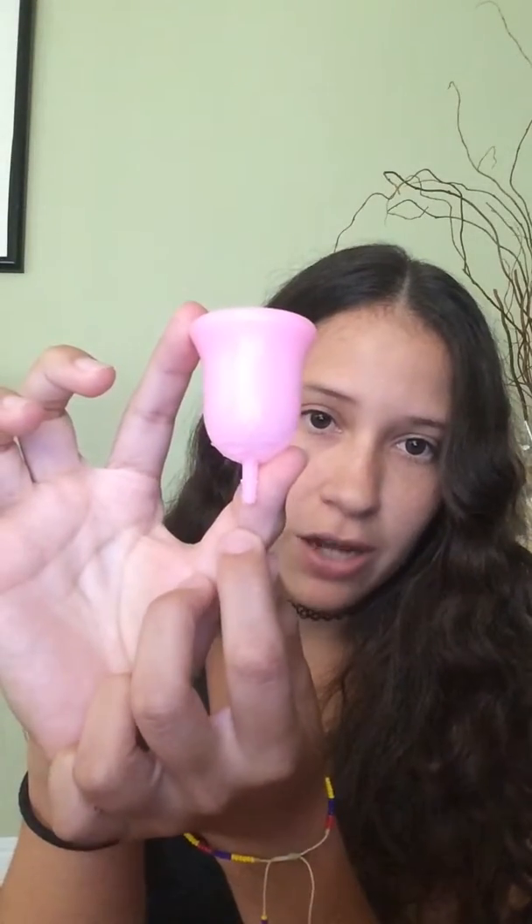The product came with a longer tail, but I just clipped it off due to preference. The silicone is a bit firm — it's not as soft as other brands, such as the Diva Cup. But for a person that has a very sensitive vagina, this actually works really well for me.